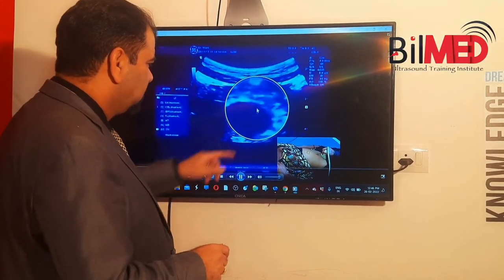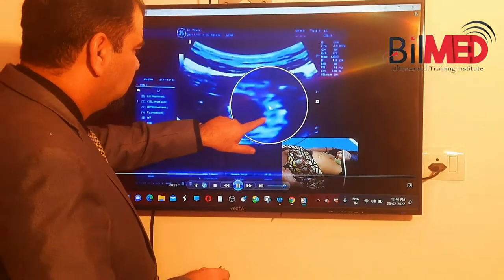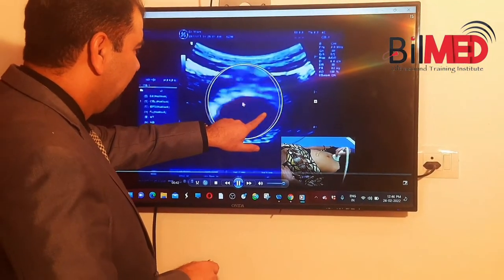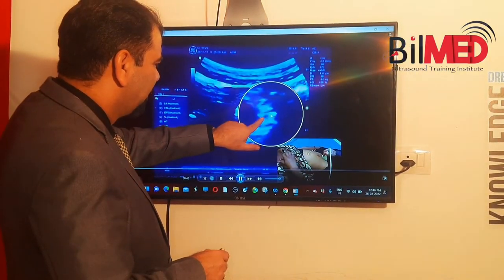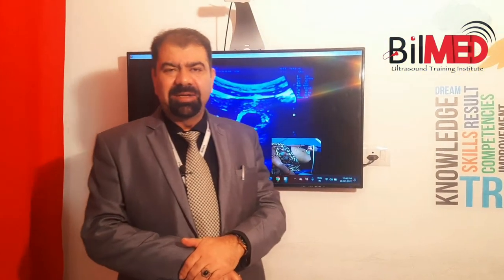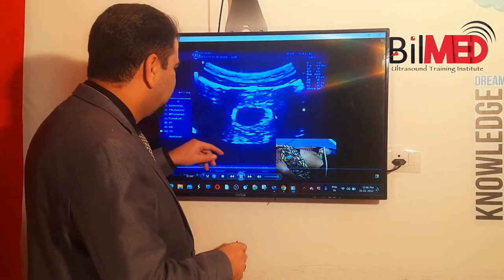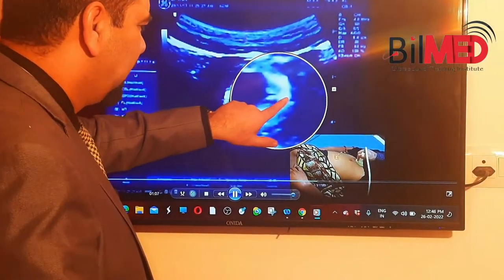At some point the decidual reaction will be more thickened as compared to the other part. See — this part is more thickened over here as compared to this part. The part which is more thickened — I can say that this is the chorionic frondosum. This is the way how you can pick the location where the chorionic frondosum is.